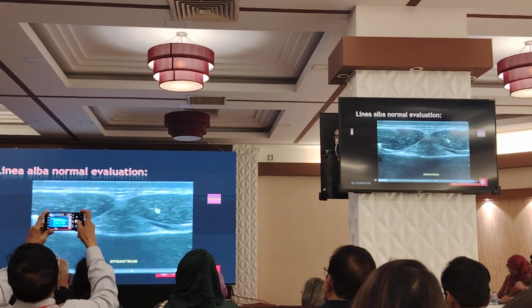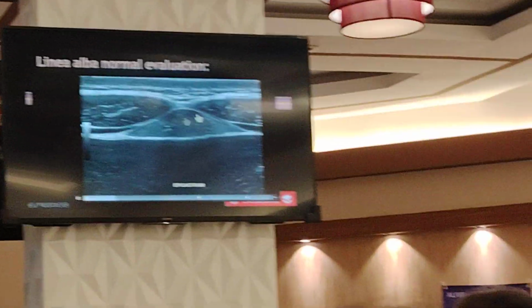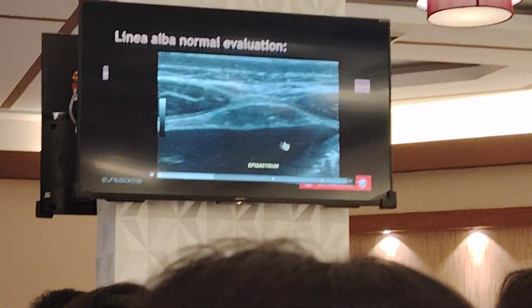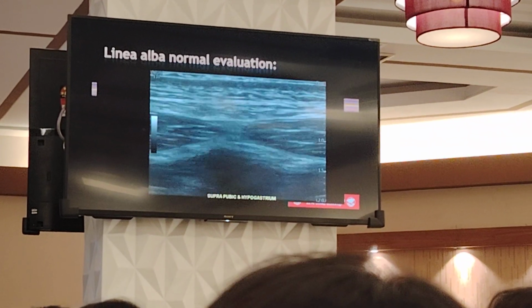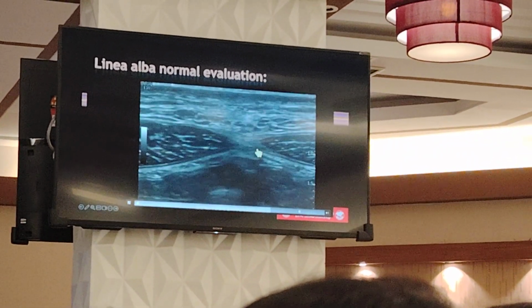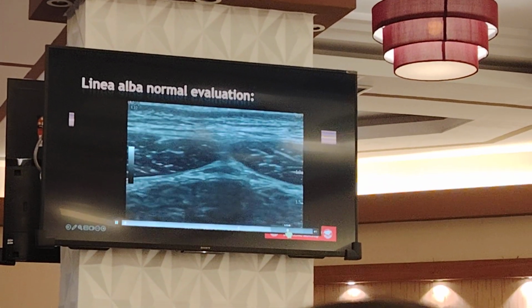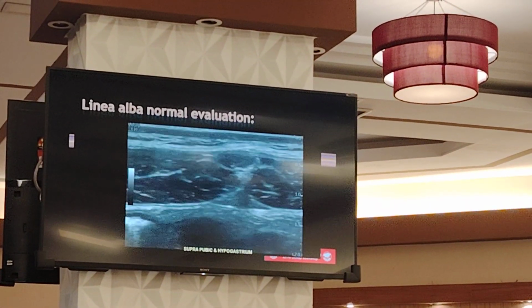So this is left rectus abdominis, right rectus abdominis, this is linea alba, this is extraperitoneal fat. At first this extraperitoneal fat protrudes into a sac through the linea alba. This is one of the commonest presentations. So right now in epigastrium, we are evaluating, this is normal. This is normal. When we go in the suprapubic area, we will appreciate that linea alba is getting narrower, and at the end, from both sides, the pyramidalis muscles will be coming up. Right here. Yeah.